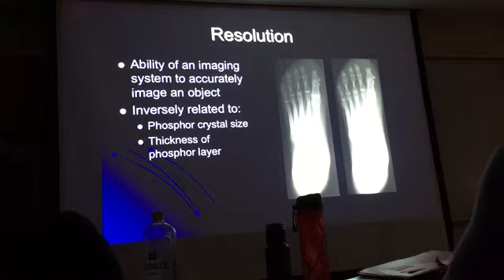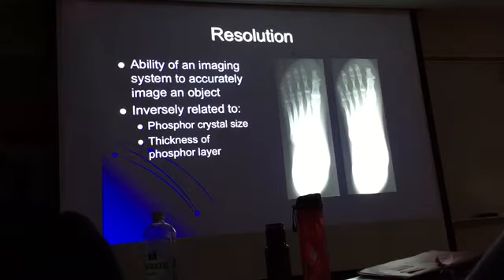I'm not sure which one is better. Which one do you like? I like both. Okay, the first one's better to me. The one on the left or the one on the right? I read from right to left. The left. Why? I can see more detail, and a little bit higher contrast. We're not talking about contrast. We're talking about resolution. Two different things. Resolution, how good the images could be. Think about it. We'll come back.